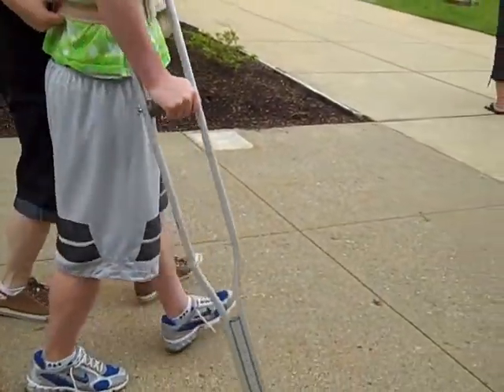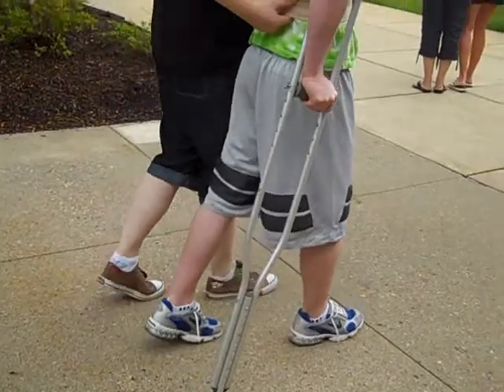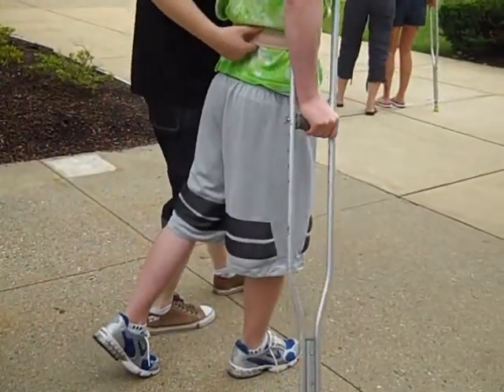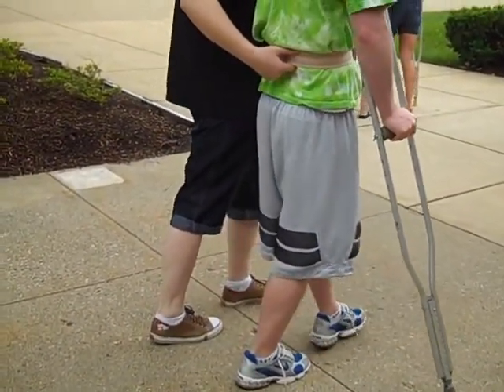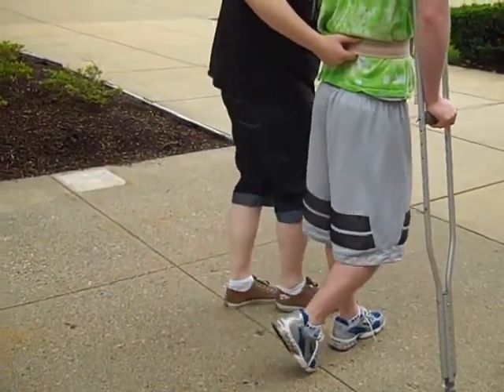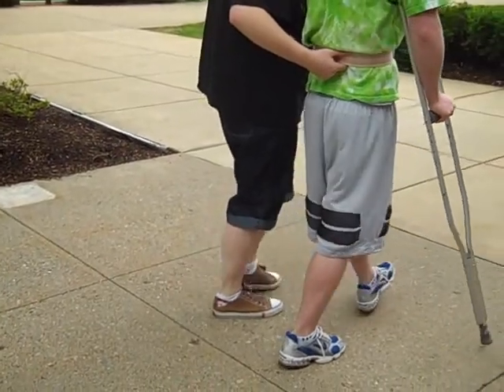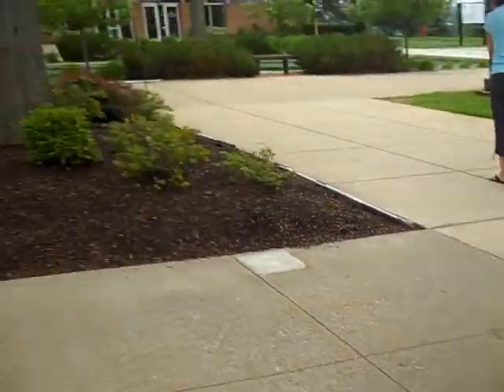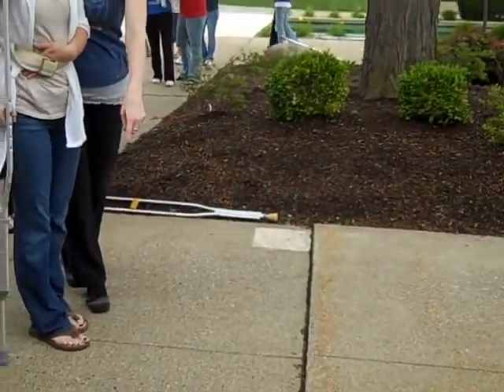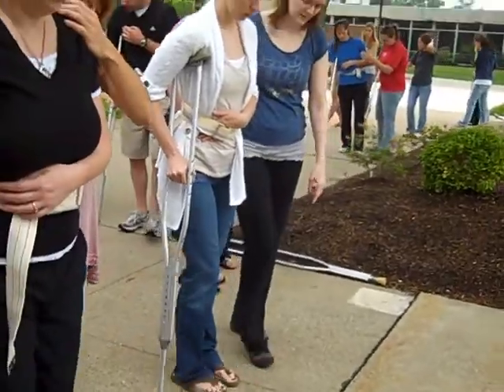Crutch and opposite foot. Just step two at the beginning, remember. Step two? Yep, at first. The other one would be crutch and involved foot.